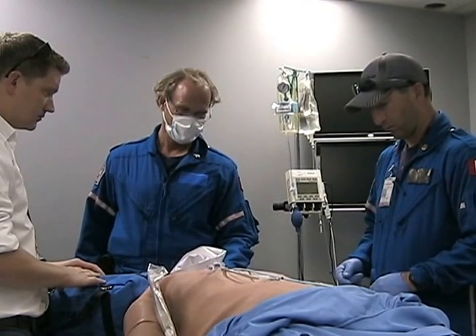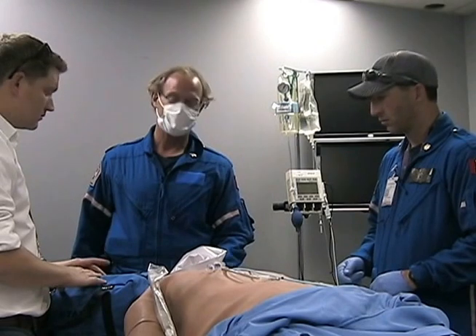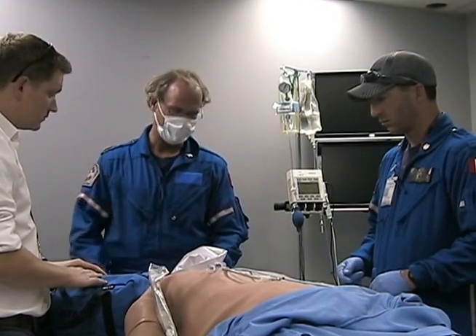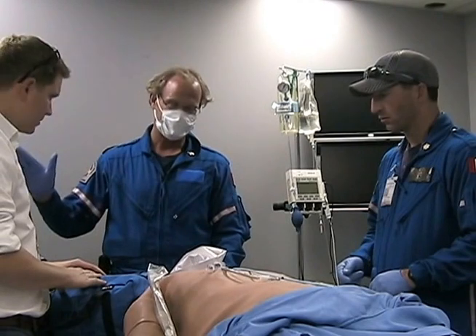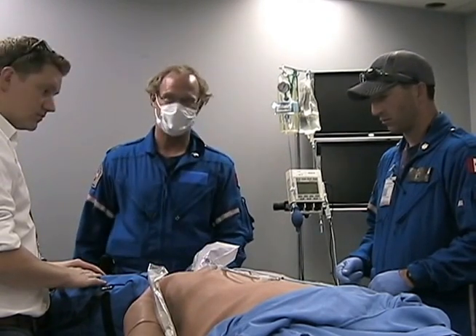Plan, sources of difficulty discussed, anatomic or physiologic. Okay, he has no anatomic and he has no physiologic difficulties as predicted by assessment. Okay. Assistant 1 briefed re ELM, suction, bougie removal. Yeah, so James is going to be assistant 1, so he's actually going to hold ELM. He's also been briefed on the other things.